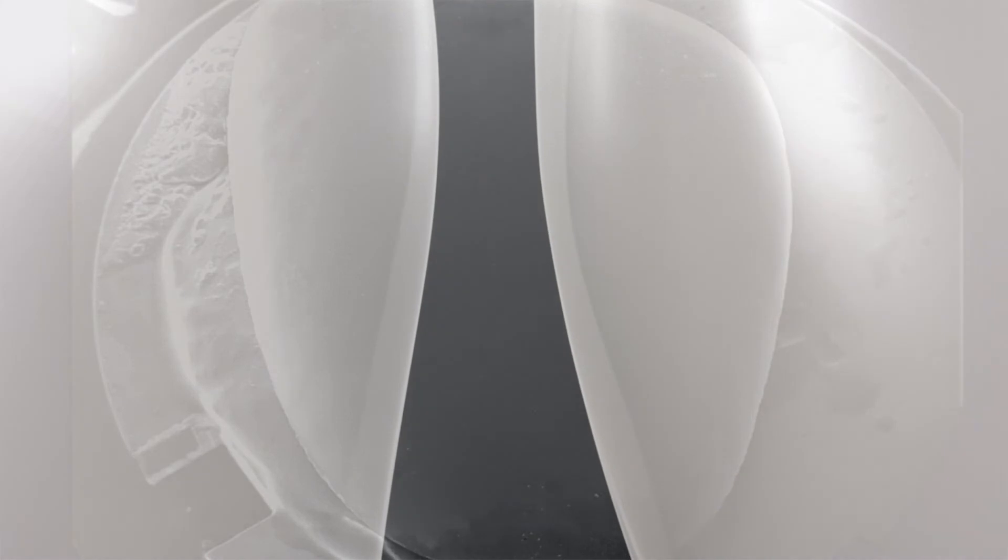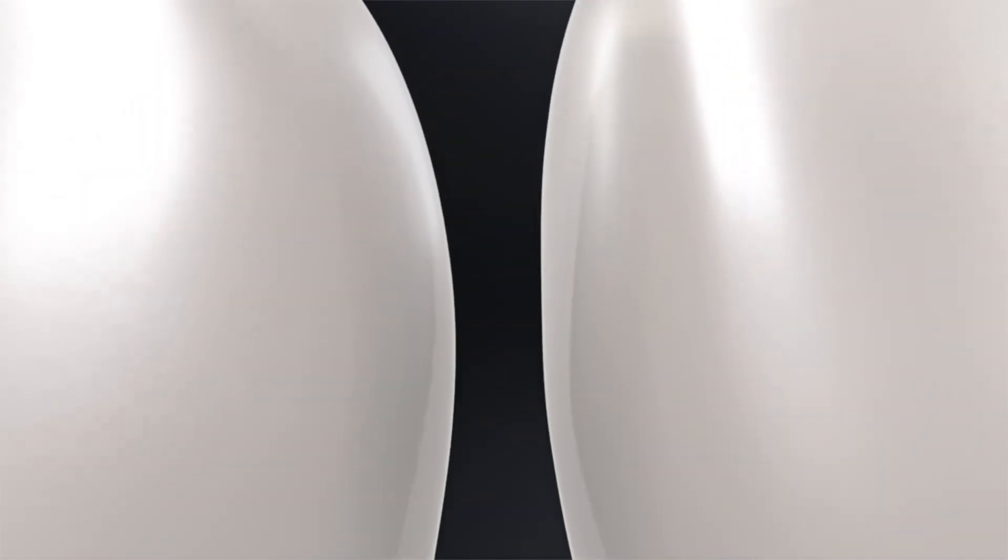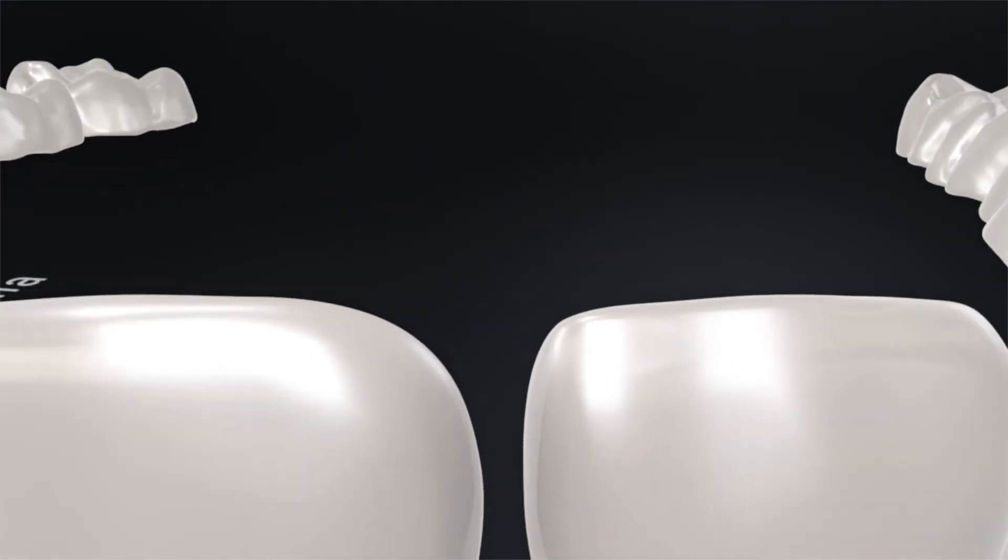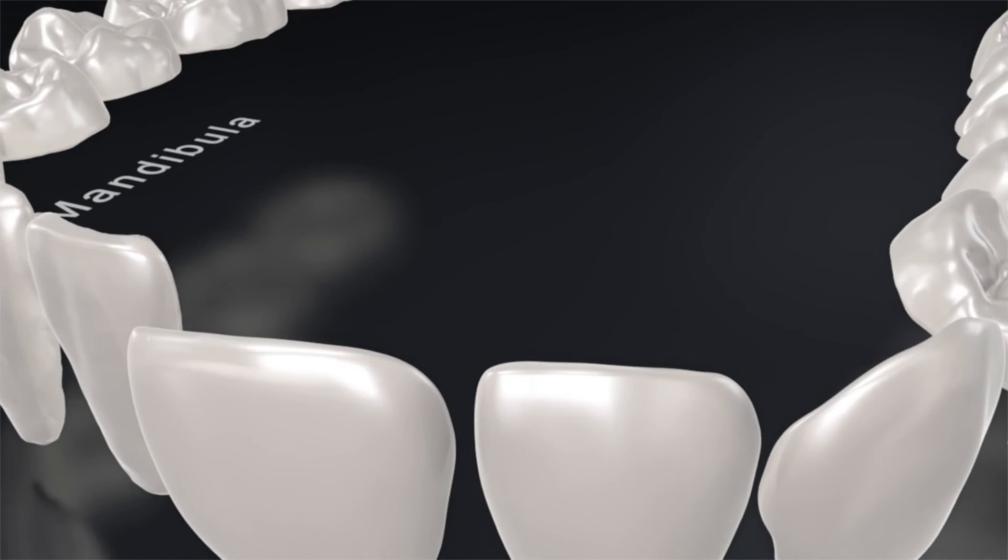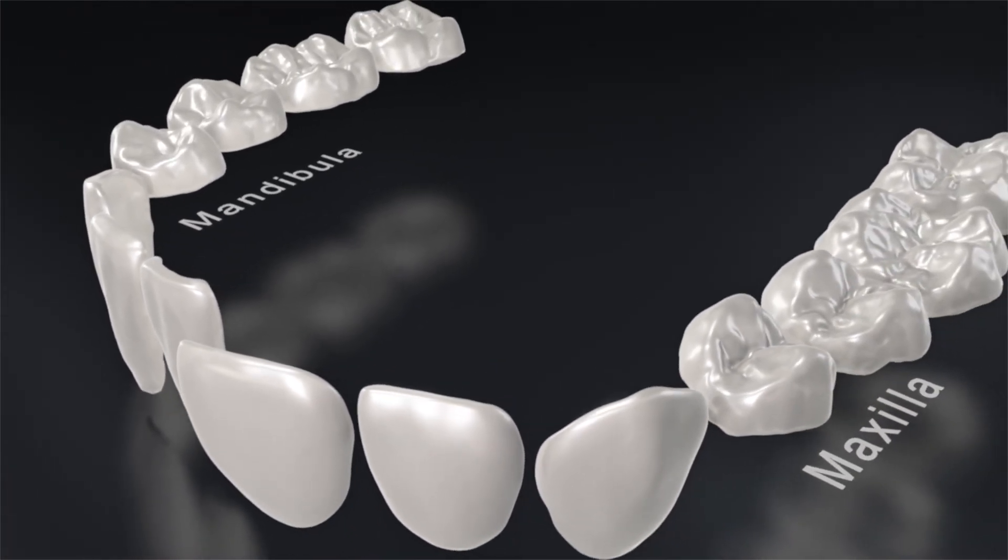The biomechanical properties of natural tooth enamel have been reconstructed optimally, merged together with natural bio-aesthetics.